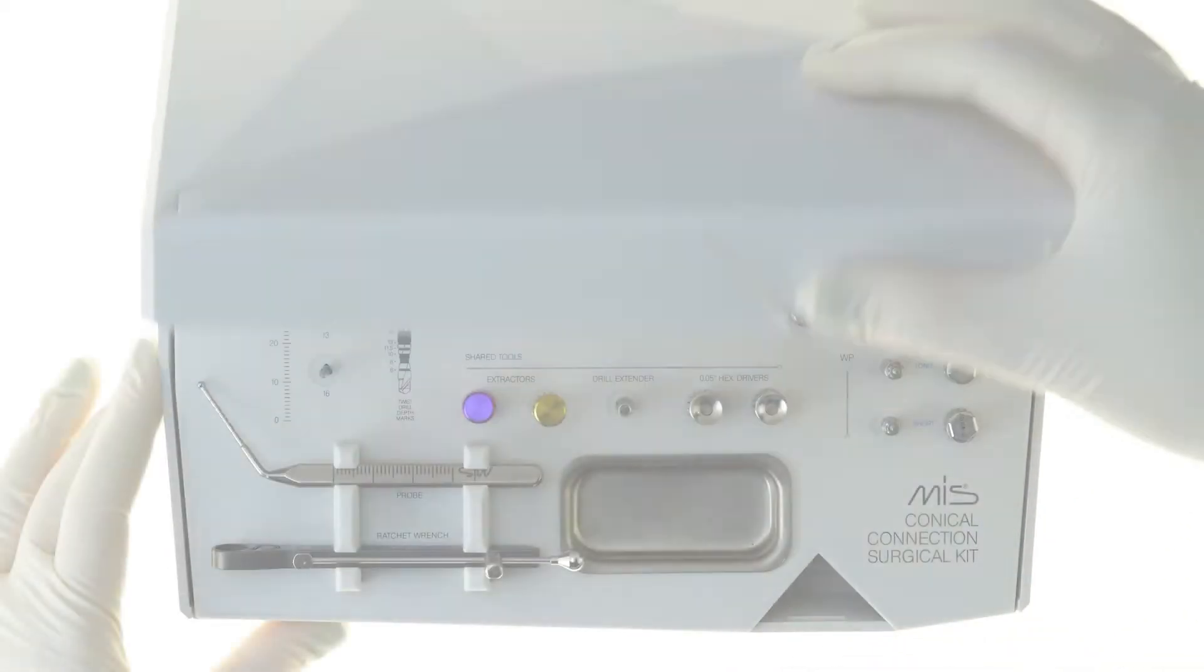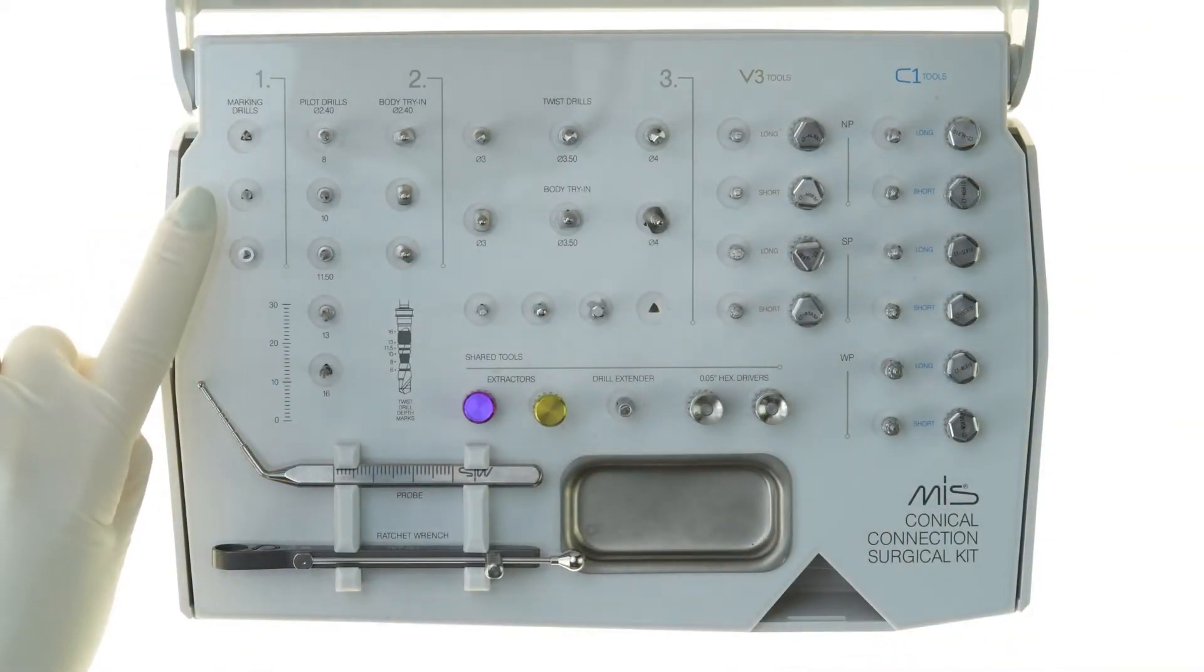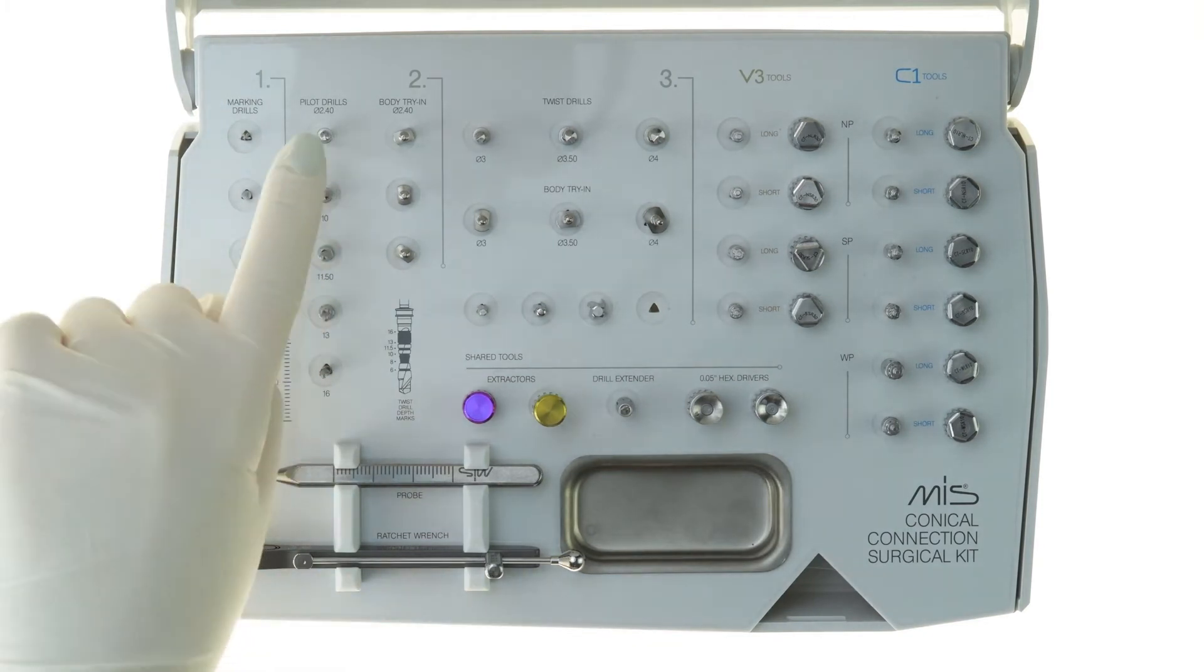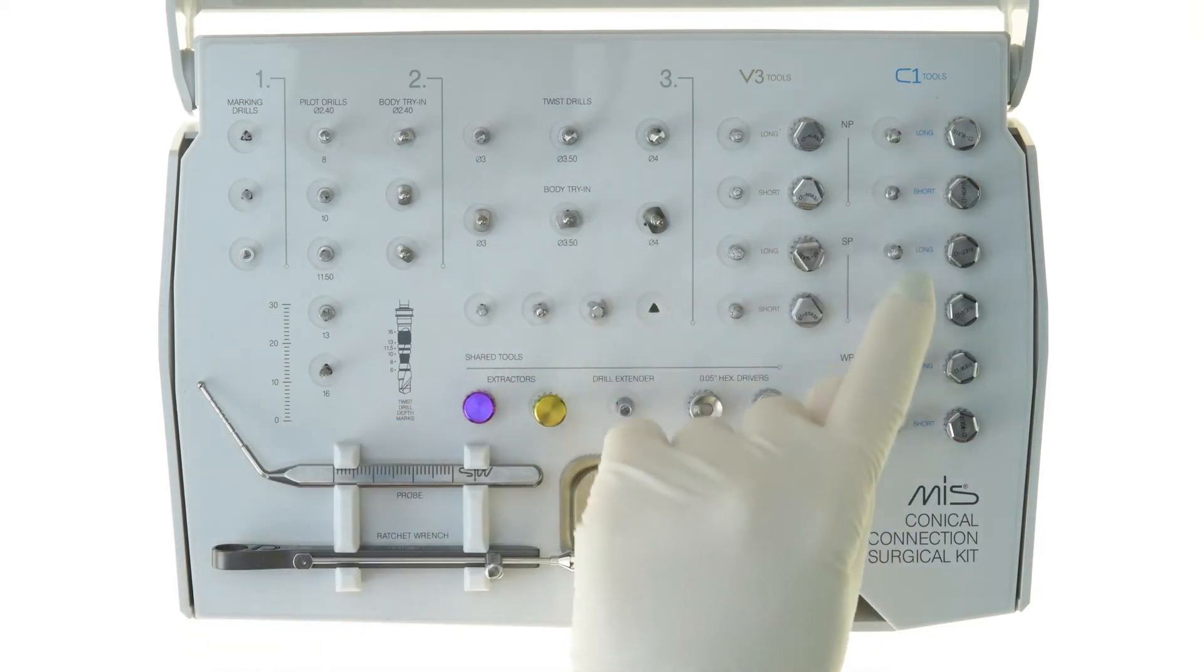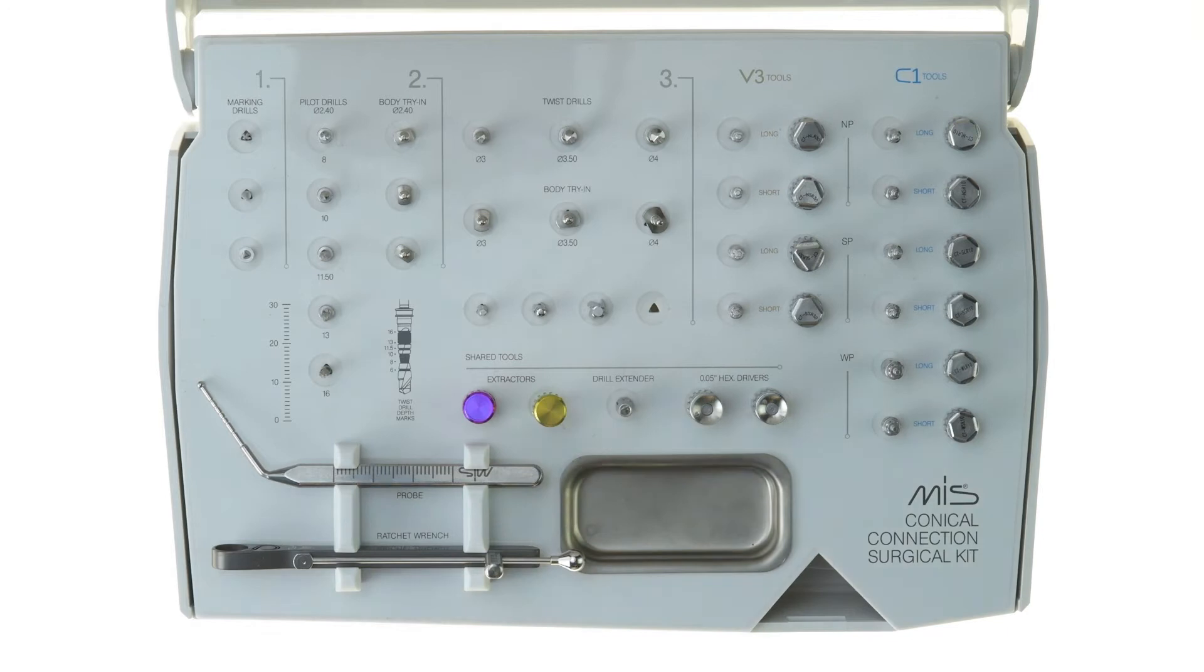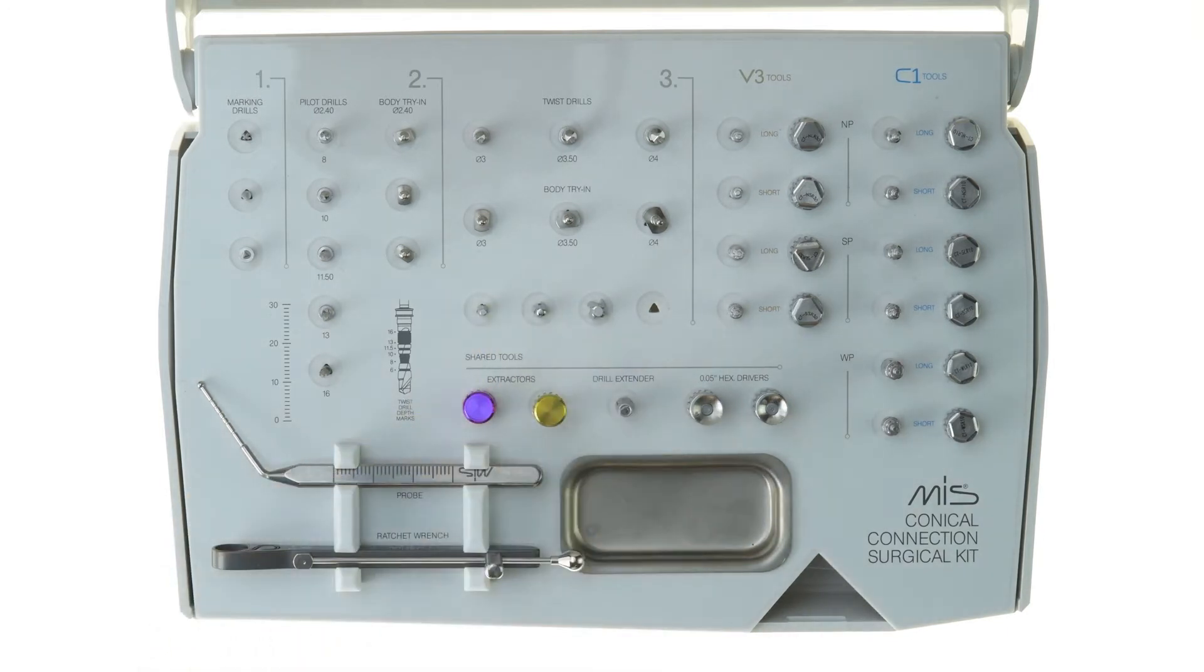The surgical kit includes all of the following items: marking drills, pilot drills with built-in stoppers, 2.4 mm body try-ins, step drills, body try-ins, C1 insertion tools, countersink drill for C1 placement procedure, prosthetic screwdrivers, drill extender, abutment extractors, probe, and a surgical ratchet wrench.